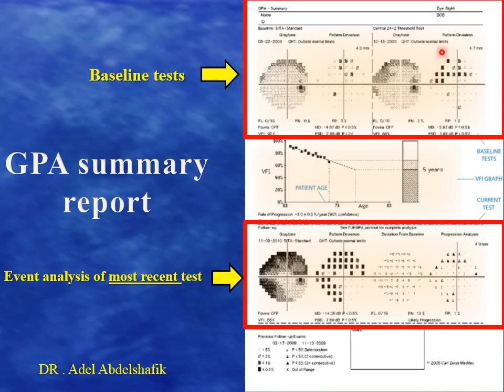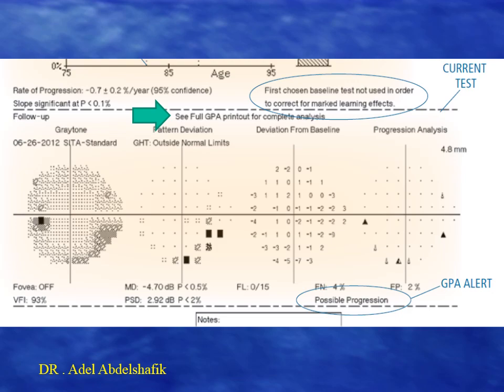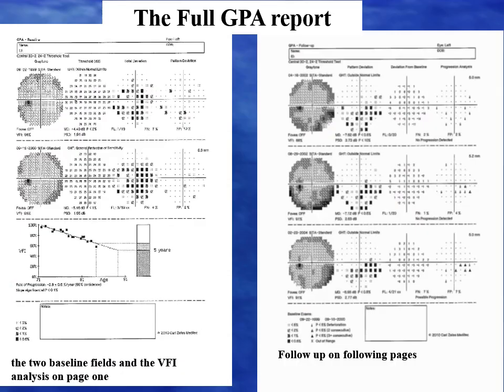In this printout, these are the two baseline examinations, this is the current present examination, and this is the progression probability for the current test. If you want to see all the tests in between, you can ask for the full progression view, as shown here — the first two baseline tests and each of the tests in between with the progression probability analysis.